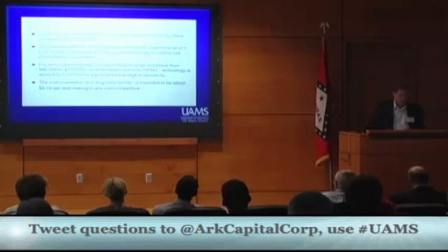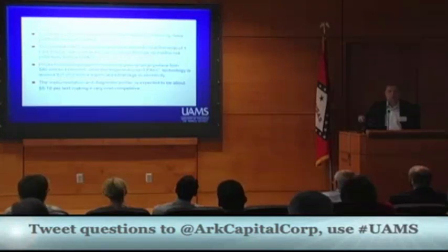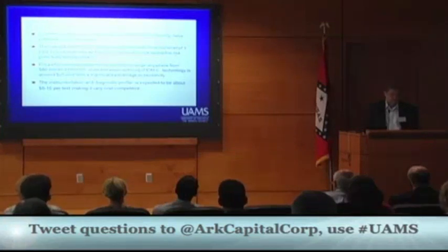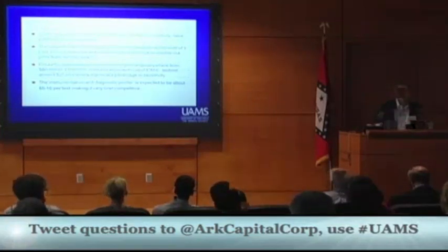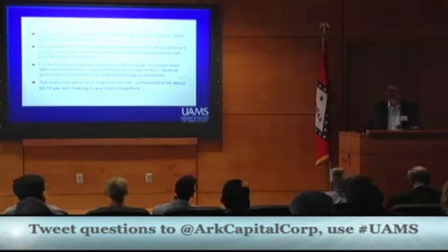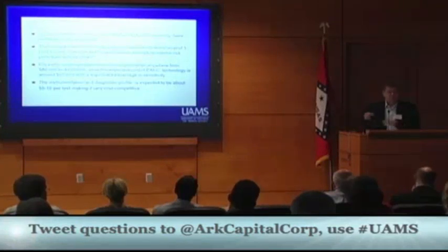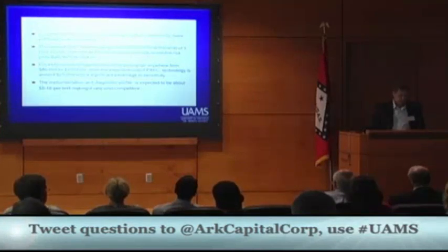Our sensitivity in animal models is approximately a few clots in the whole volume, 2 milliliters of blood or 20 milliliters of blood. Its size in vessels of 1 millimeter diameter is approximately 20 microns. No technology can detect it in vivo, or even in vitro, because if you put blood in a tube, it's natural clotting. You cannot say exactly whether it happened during processing, preparation, or before. This is the main problem. We're working with Harvard and Stanford. They developed an excellent ex vivo device, but even then we discuss whether it is valuable or has artifacts during preparation of the sample.